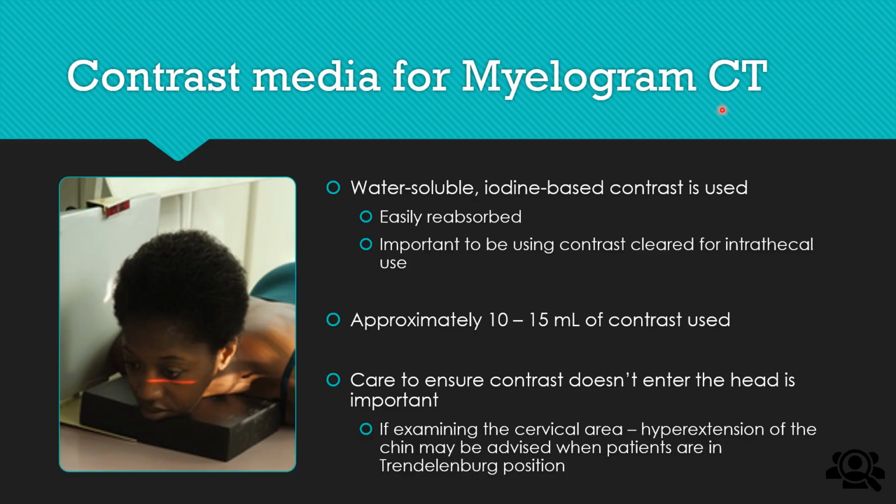Contrast media for CT myelogram. So we can do myelograms with CT or with MRI. Water-soluble iodinated-based contrast, easily reabsorbed. Important to use contrast cleared for intrathecal use. Intrathecal means in the spinal canal, so it's not oral. The bottle of contrast will actually say for intrathecal use only or not for intrathecal use.